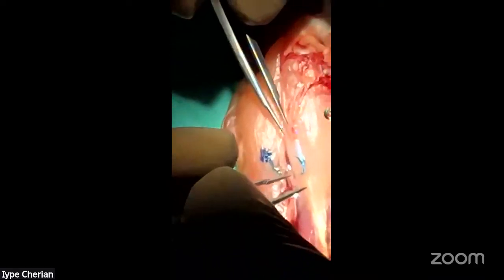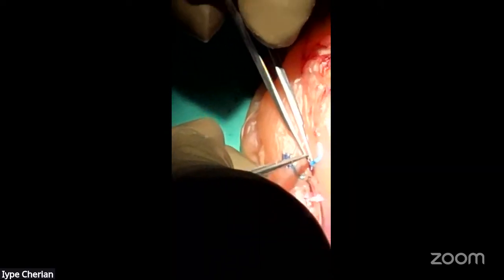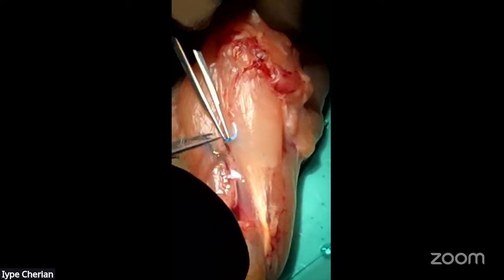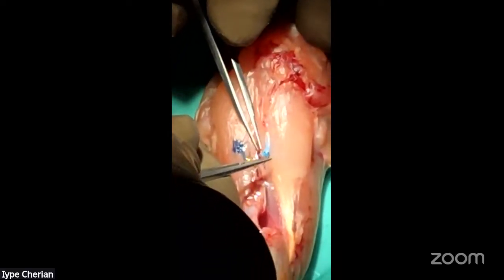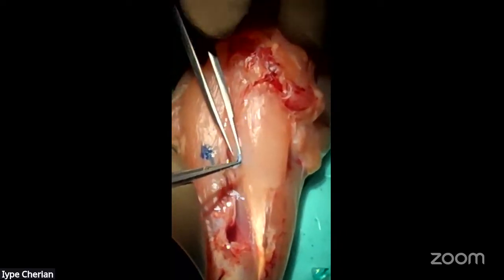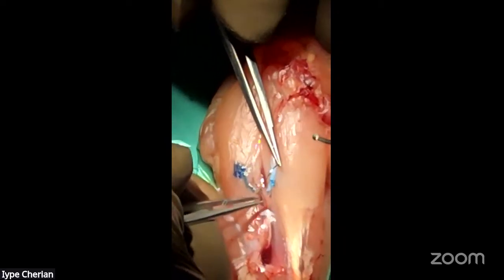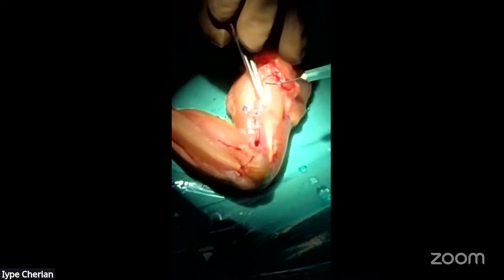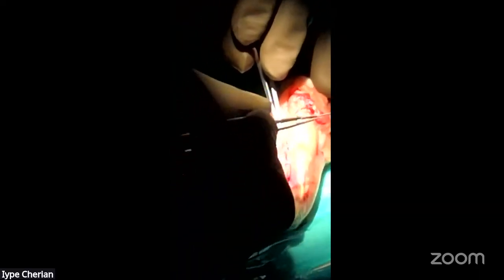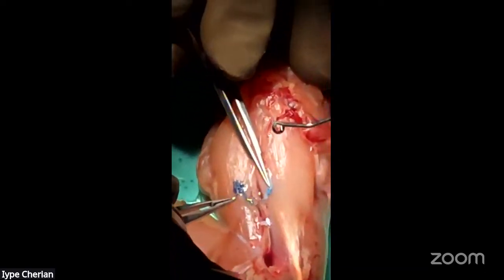Yeah, I know. The needle is too big. Too many challenges, but that's how it is. It's fun. It's unrestrained. So unrestrained anastomosis is when the vessel is not fixed.